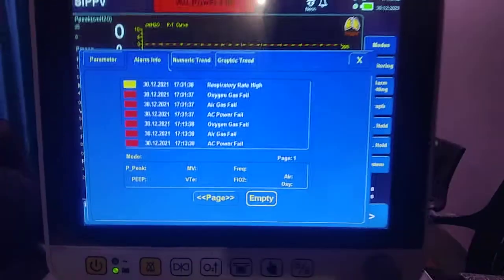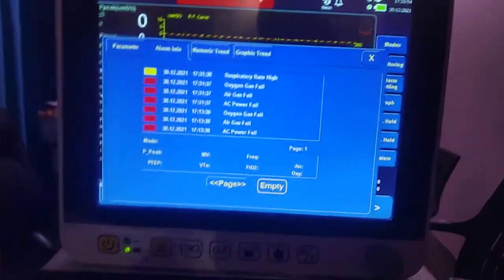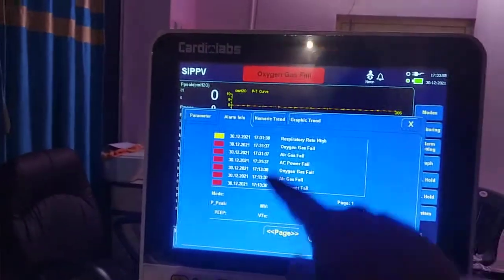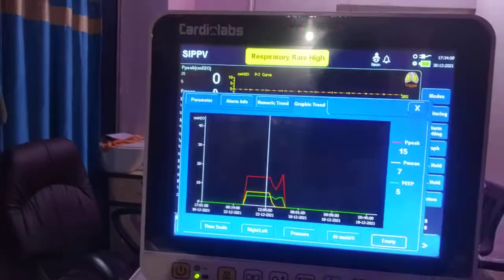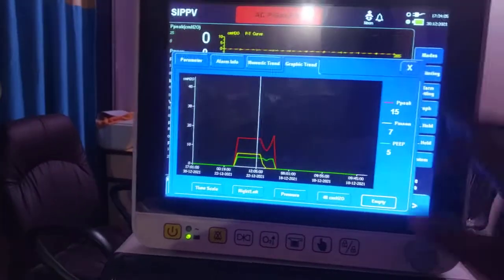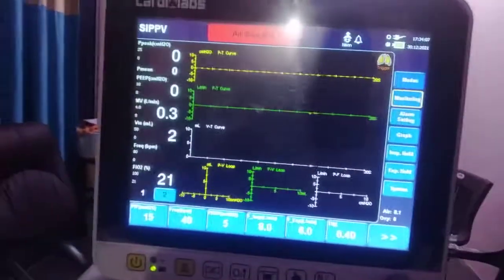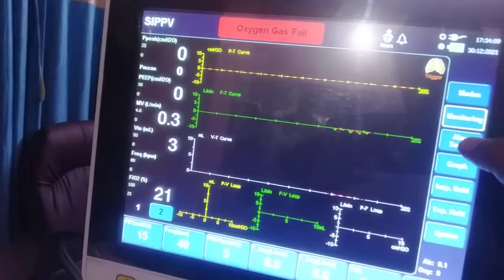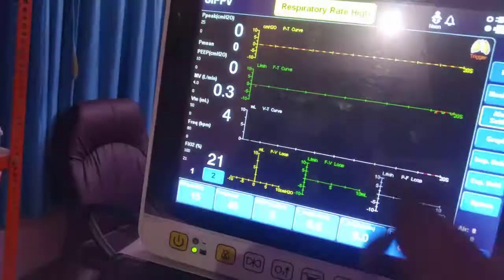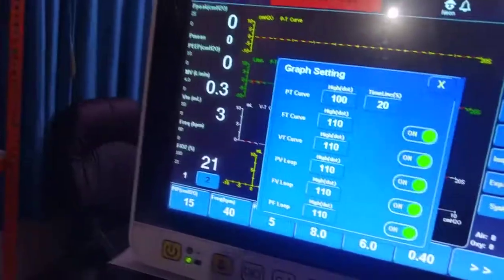There is also alarm information: you can get all details about every alarm that was triggered — the reason and the time. A graphical trend is also available where you can check trends from graphs. You can also do alarm settings from here — if you wish to change any alarm limit at any point, you can do it from this menu.